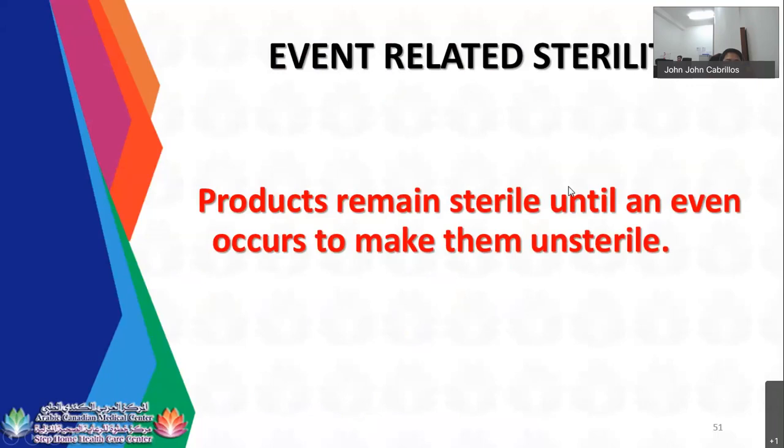So that's event-related sterility. There are two types of sterility: event-related and time-related. Event-related, your pouches and packages are sterile unless the integrity of the package is questionable. If it is intact, there's no moisture, there's no wet, then it is sterile.